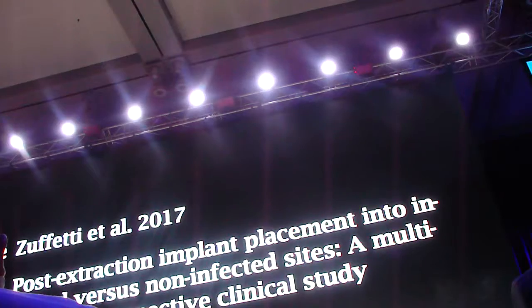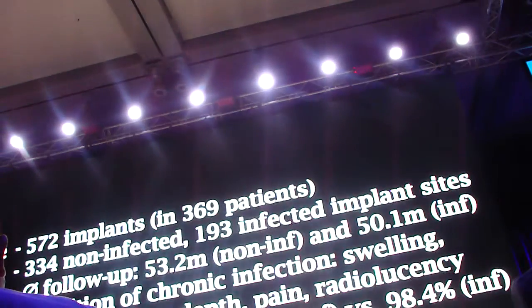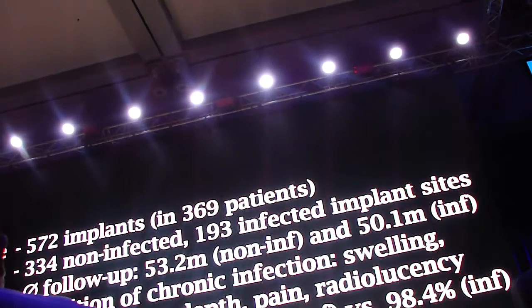So let's go back to our field. In 2017, we have a retrospective study on the topic post-extraction implant placement into infected versus non-infected sites. And let me summarize this: quite a lot of implants, 572 implants, the retrospective study. Non-infected sites, infected sites, follow-up for both 50 months, so that's a good amount of time, 4 to 5 years for both groups.